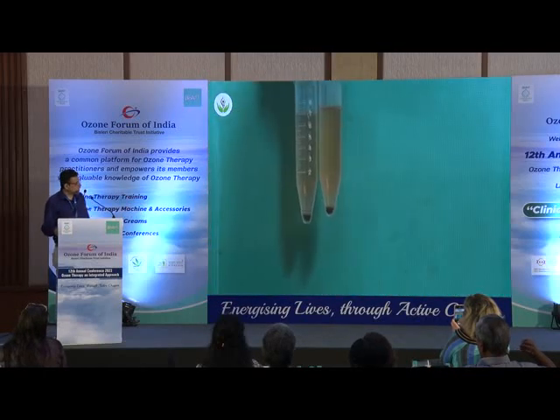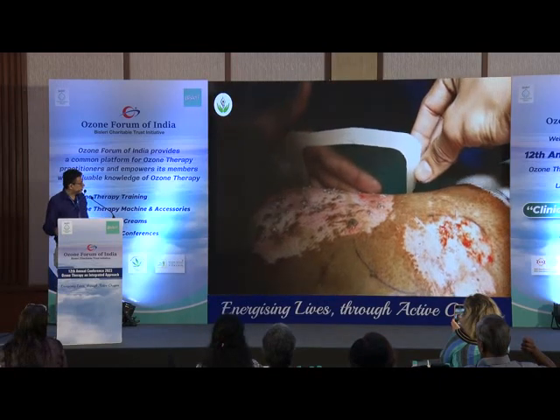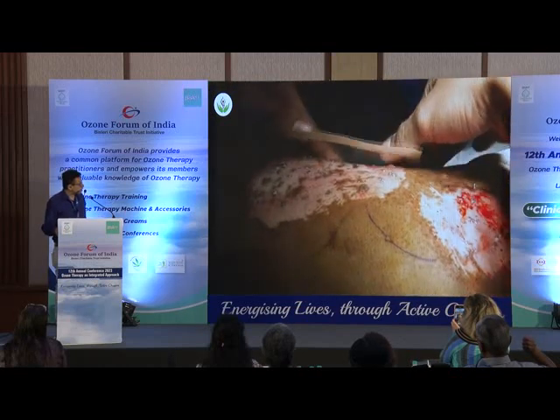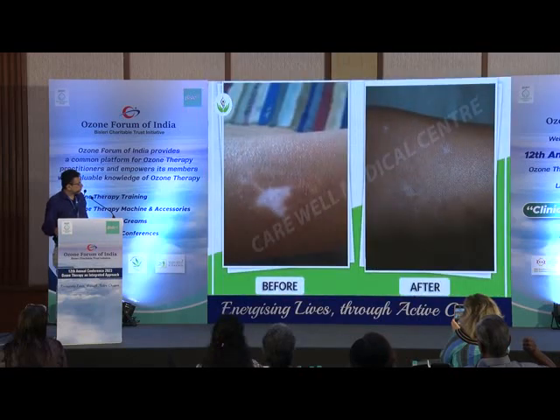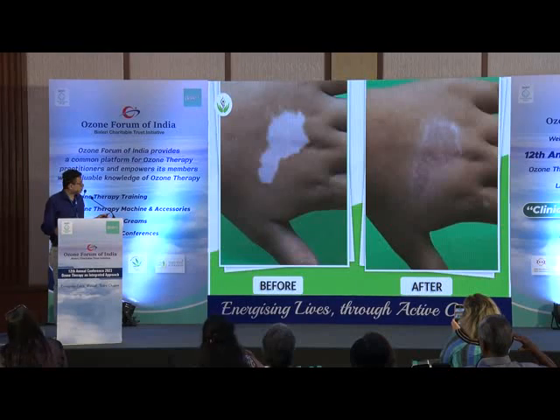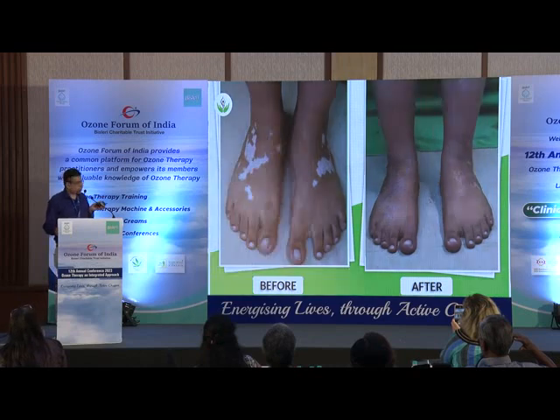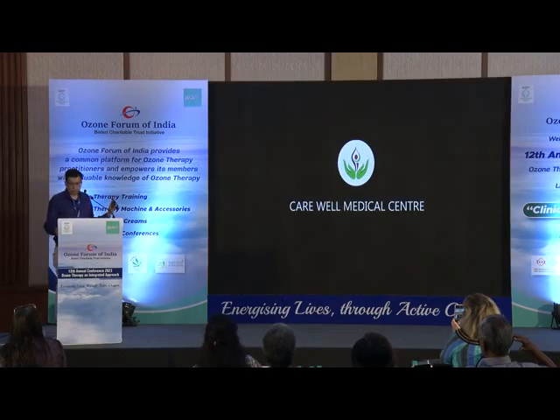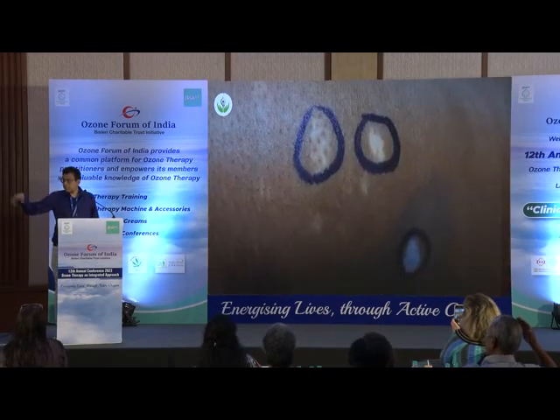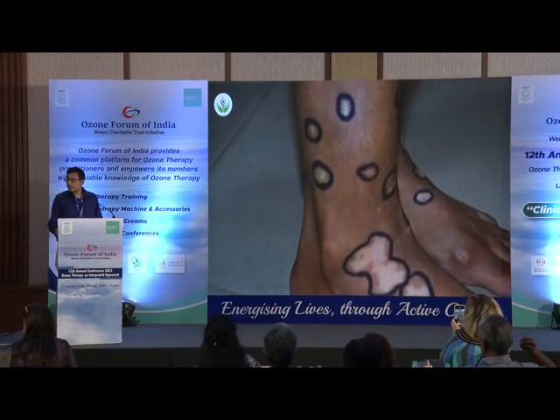Now, these are the melanin pigment. Can you see this? After trypsin and other things, we separate the melanin pigments. On the white patches, we are putting these melanin pigments. And I got some videos where we are just showing you what kind of results we get with this. These are the results of our surgery, but this short video is what I wanted to show you, how this surgery is done. So you see what this procedure is, what this surgery is.